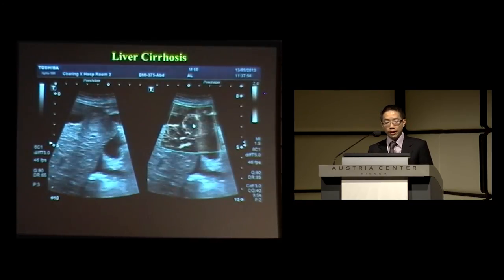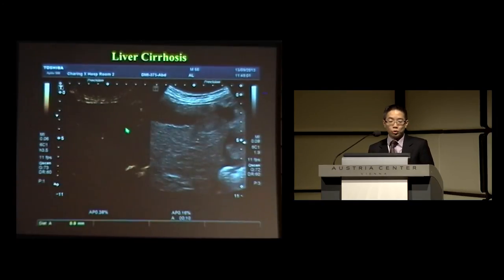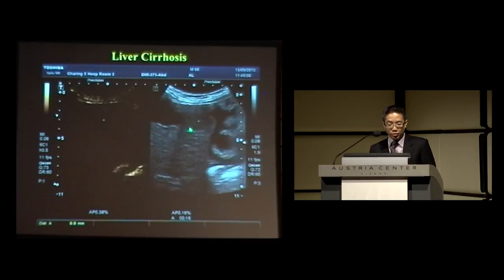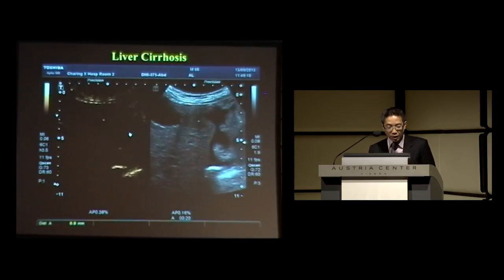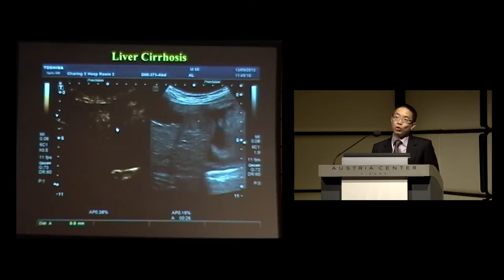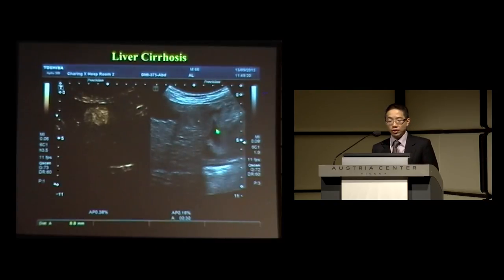And here it is again. Of course, because we rely on contrast, we gave contrast to show the avid arterial enhancement of this lesion in the arterial phase. Here it is, and there's the time. And you can see as this lesion enhances, you get the impression of that basket weave pattern, but perhaps not as clearly as you do with SMI, and this just confirms that this is an HCC.